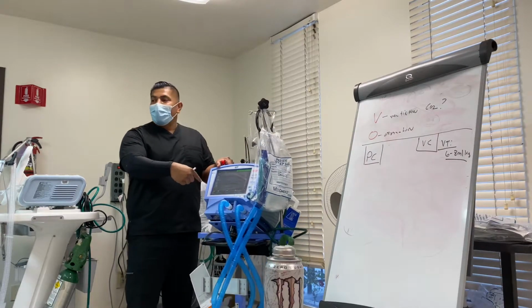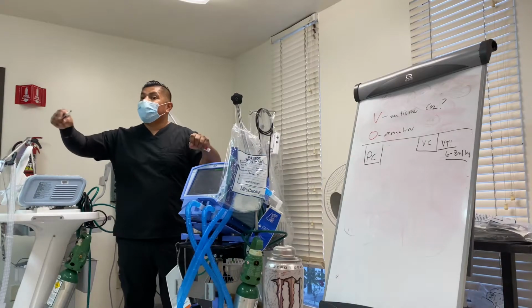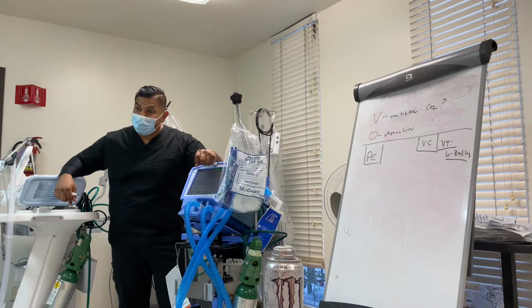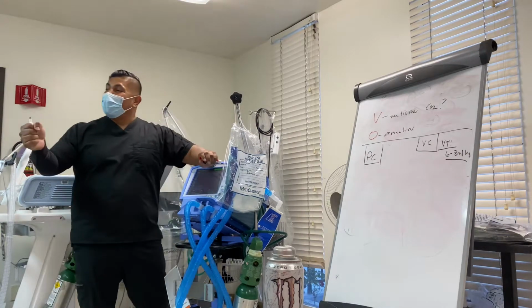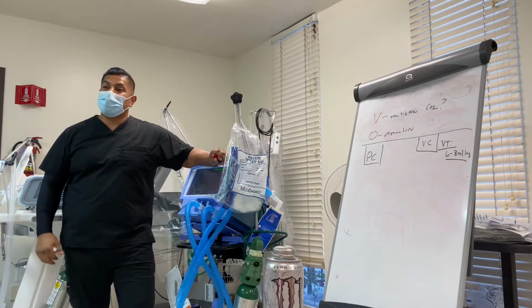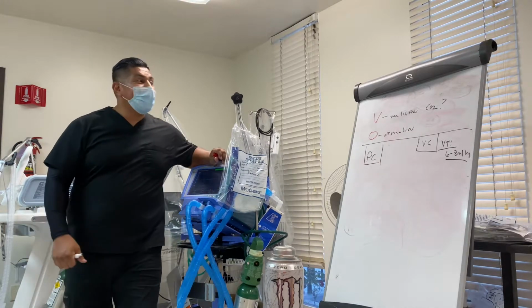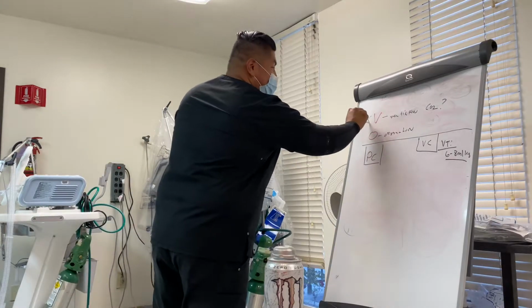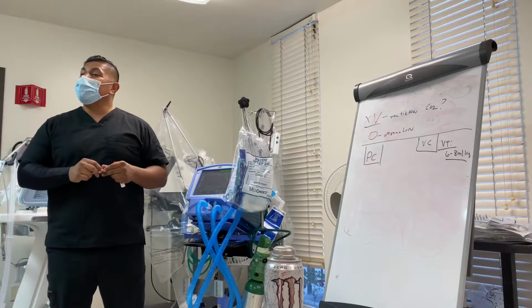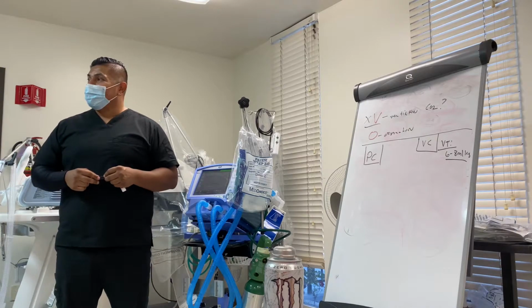What is not on there? Volume. Tidal volume. Am I controlling my CO2? No. I will not have full control of my CO2 as I would with PRVC or volume control. I have now lost the ability to control this. That's why doctors do not like pressure control.